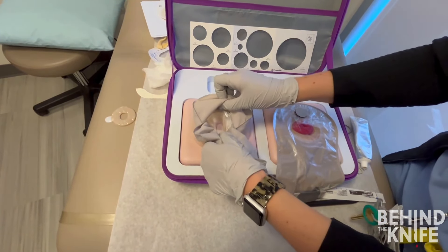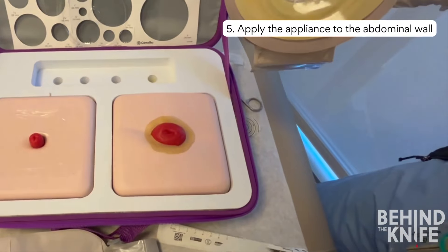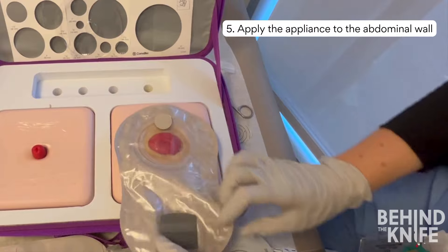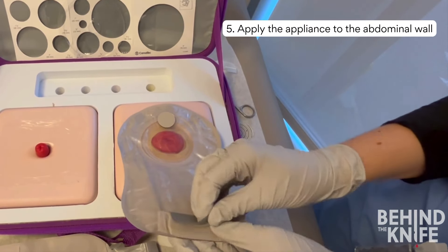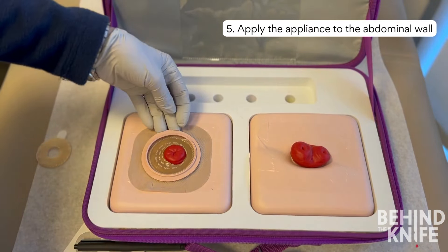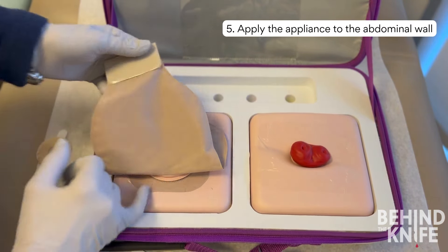Regardless of whether you use paste, an ostomy ring, or just the appliance, you will then apply the appliance to the abdominal wall. Make sure the surrounding skin is dry before applying so you can get a good seal. If you are using a two-piece appliance, you will apply the base and subsequently attach the bag, similar to the lid on a Tupperware container.